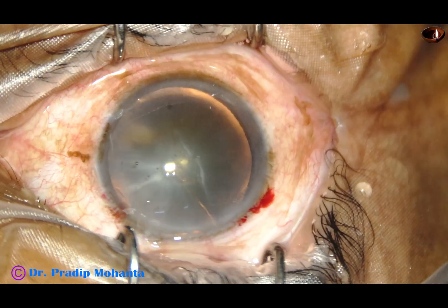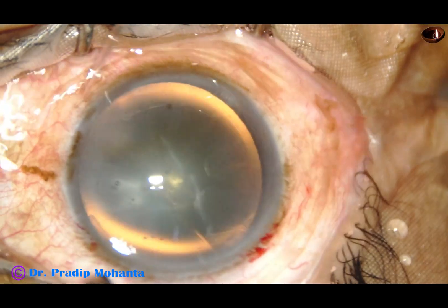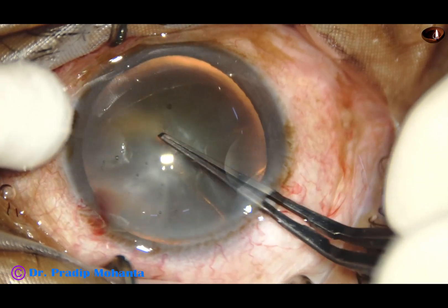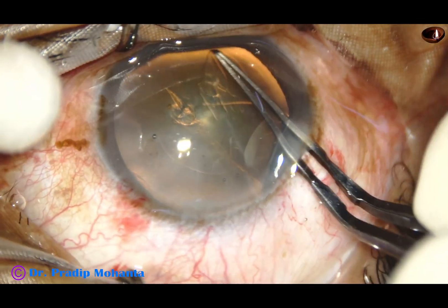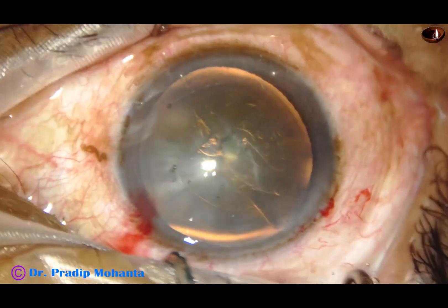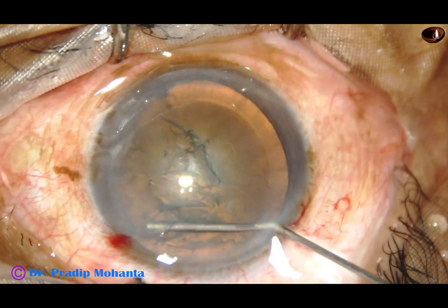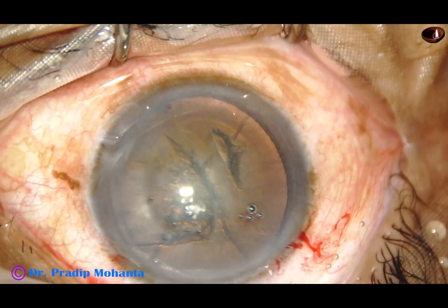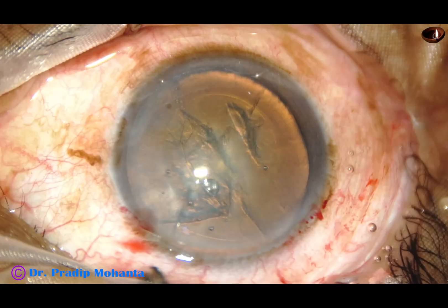After making the incisions, the side port should not be very small. It should be at least 1.5 mm so that the pre-chopper and the nuclear sustainer can go through easily. Make a good rhexis. The size of the rhexis should not be less than 5 mm — it can be up to 5.5 mm. Beginners will find it comfortable if the rhexis is on the larger size initially, but be aware that you can easily do it in a 5 mm rhexis.